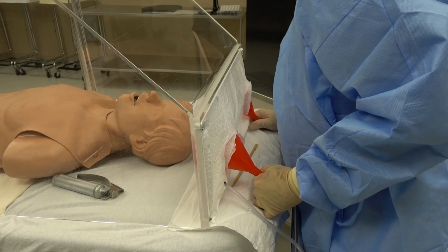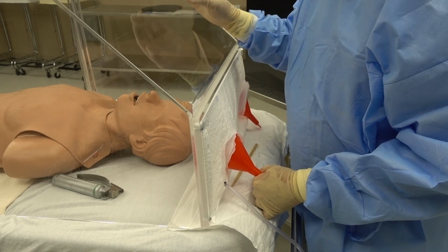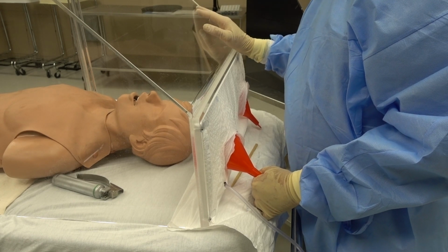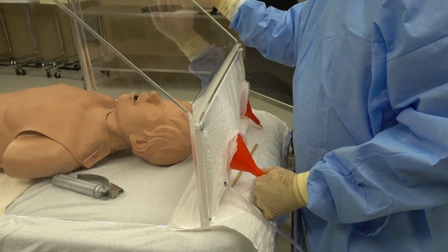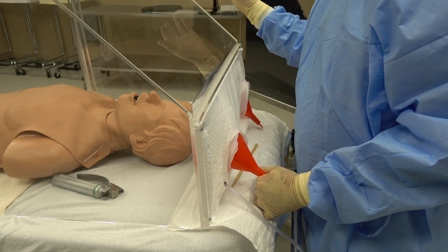What else to tell you? That's about it. You want all your equipment. You want your ambu bag, you want your scope, you want your mask, you want everything inside of there before you start. And of course you want the back on it. The other box has an open bag. And I like a complete closed system so there's no viral load going in the room.